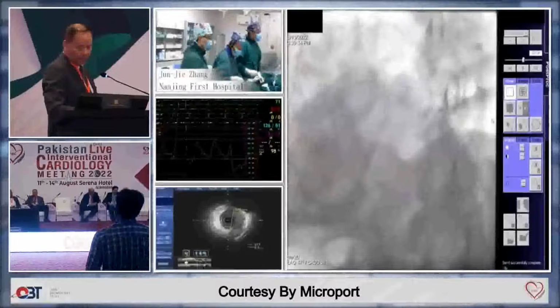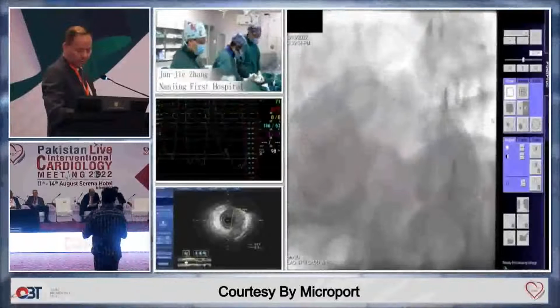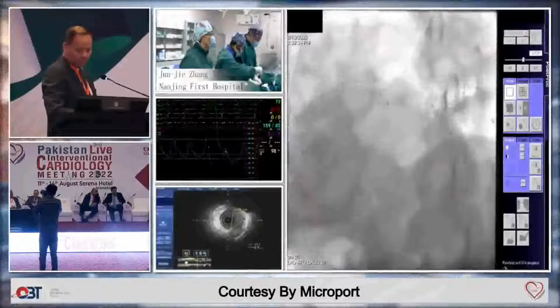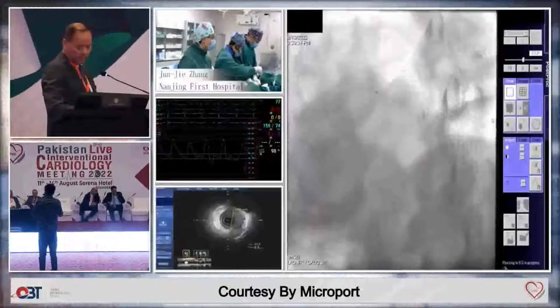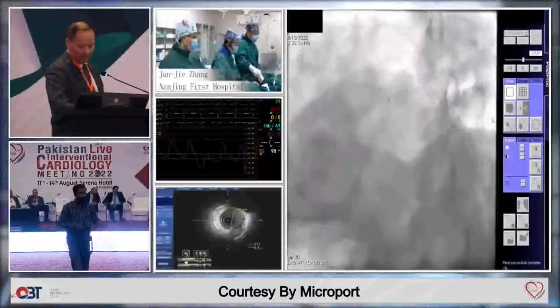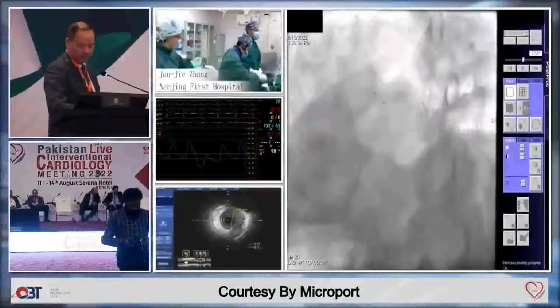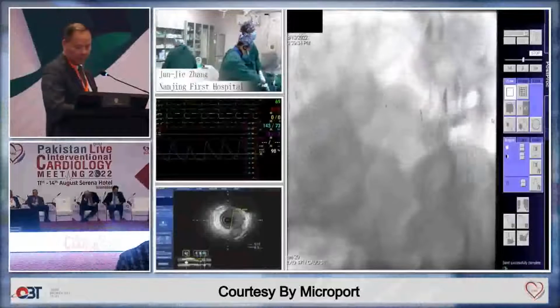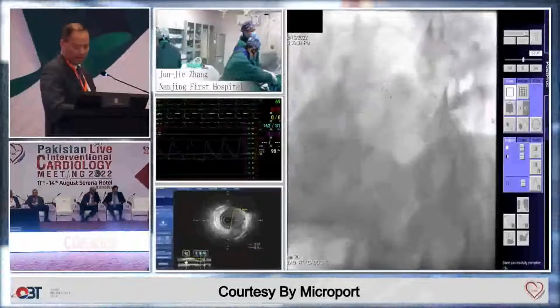After SBO, we also check the angiogram, and there is no complication for the circumflex. So that step is very important. For DK crush, we will use a 3.5 balloon to do the balloon crush, and the balloon size is chosen according to the distal left main lumen diameter.